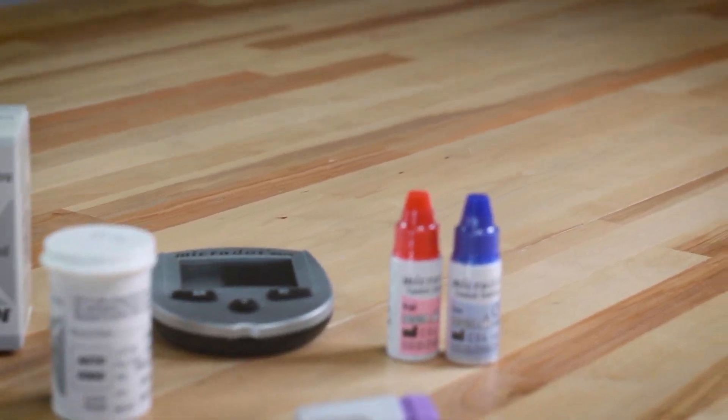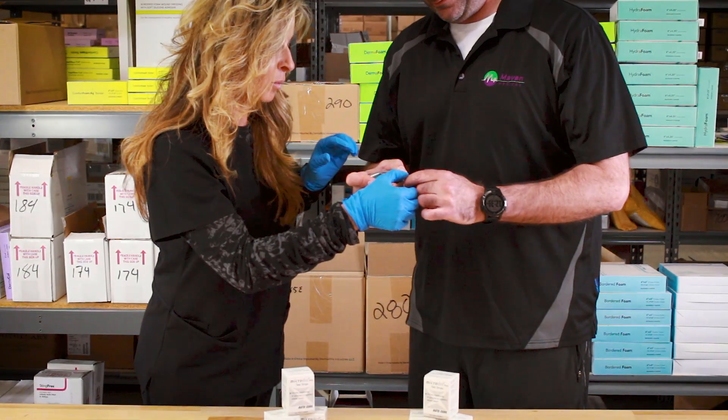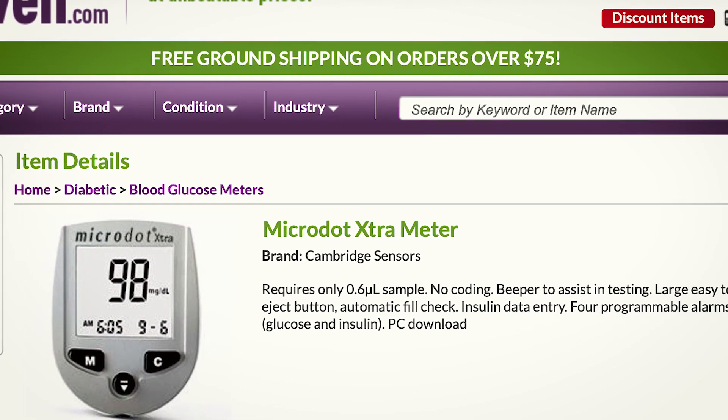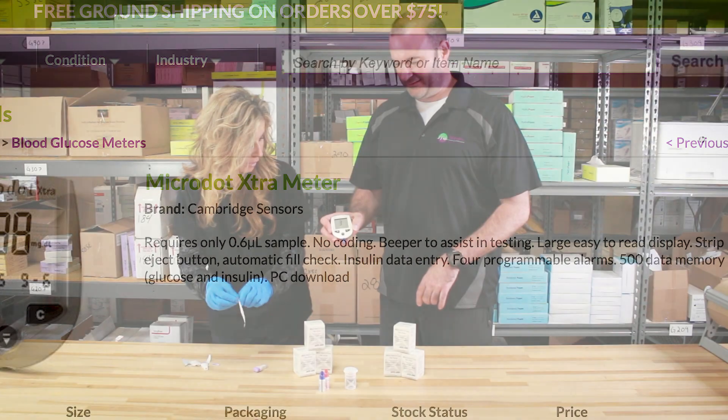Ready? And then he's going to do it himself. All you need to get is 0.6 microliters of blood, and it only takes 10 seconds for the results to come out. I guess I should get the bandaid ready for you.